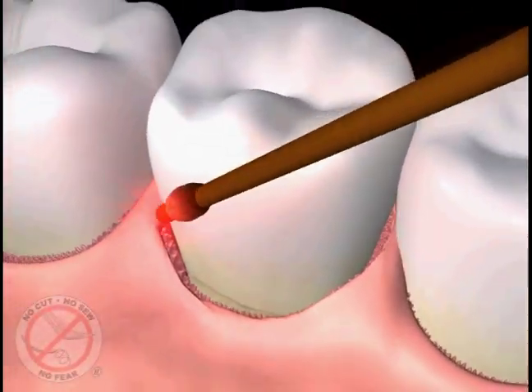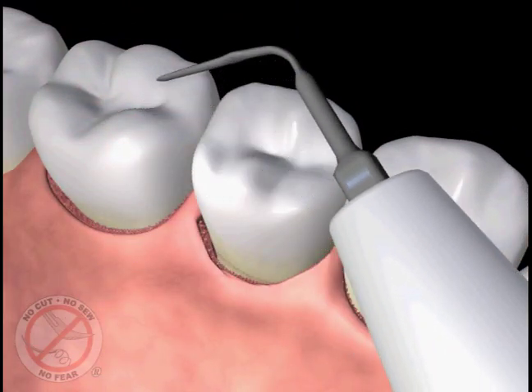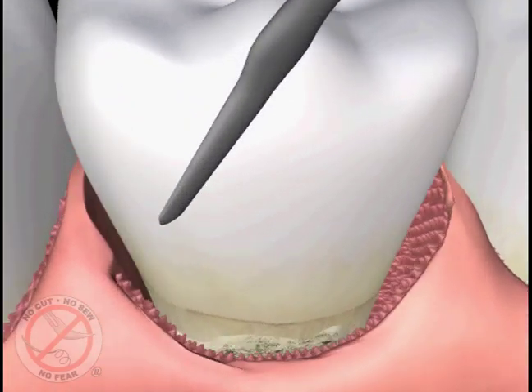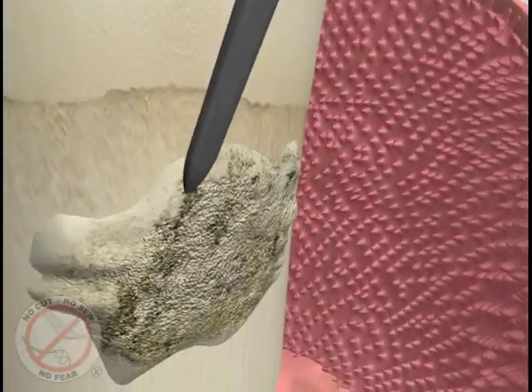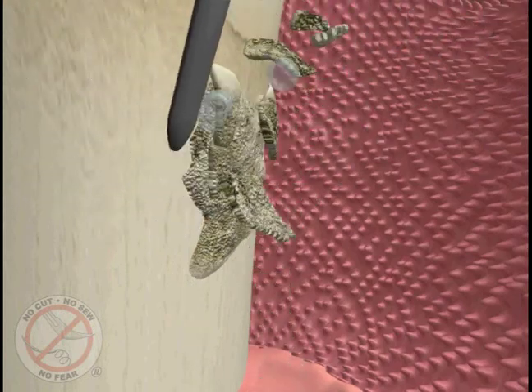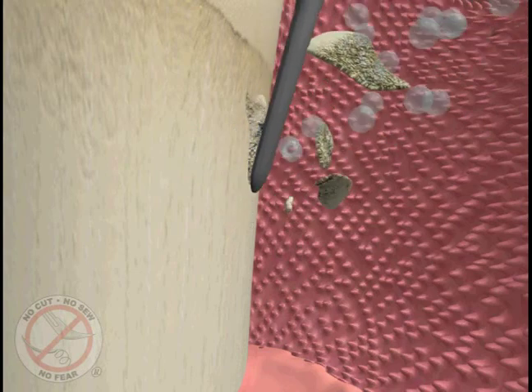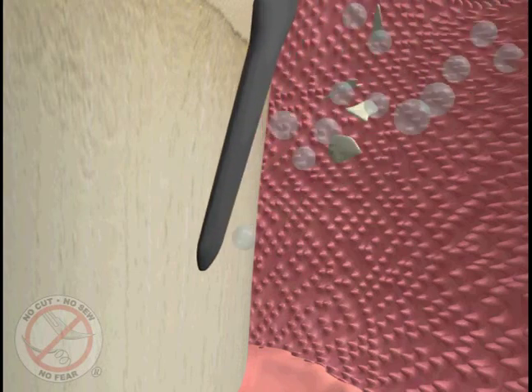The laser tip is then removed from the pocket and set aside. In the next step of the procedure, ultrasonic cleaners as small as a laser fiber tip are used to remove the hard deposits we call tartar or calculus from the top of the teeth and roots. These instruments use sound waves to vibrate and break apart the hard mineral calcium deposits, with water flushing away the debris and cooling the instrument tip. Some hand-cleaning instruments may also be used at this time to remove any remaining hard calcium deposits.